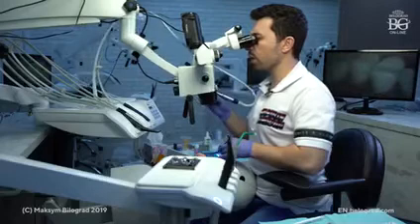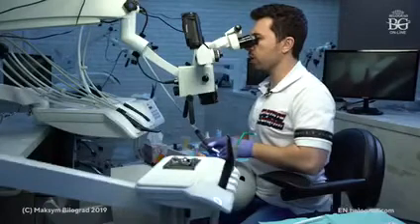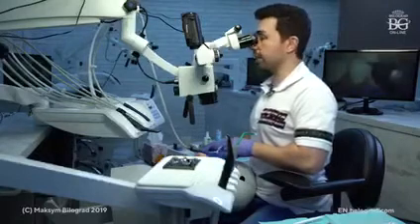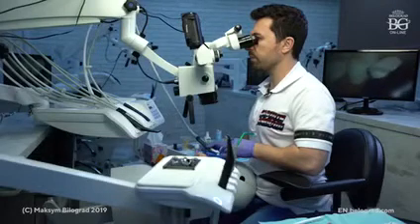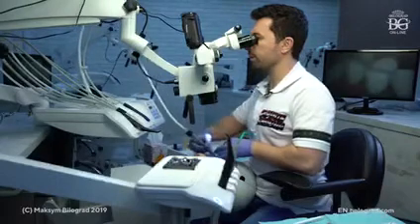Okay, also what I would like to see is the distal and mesial transition joining this outline. This is the outline which is the finish line for your dental technician. So we have to join here. Same from mesial.